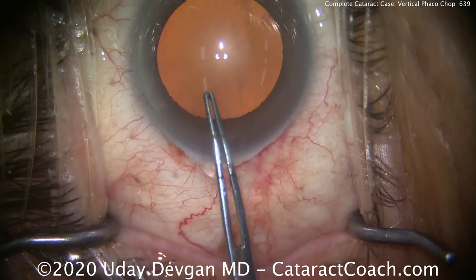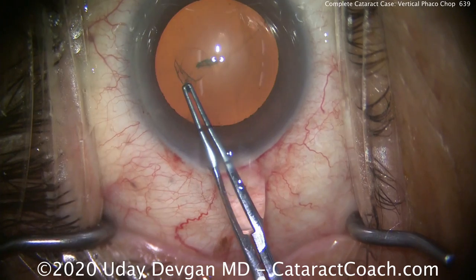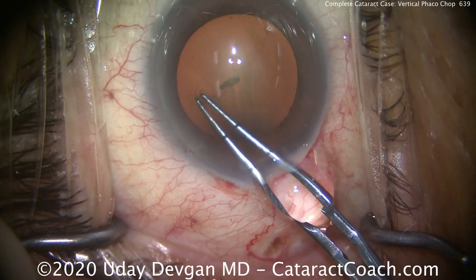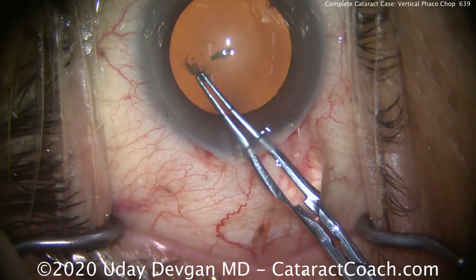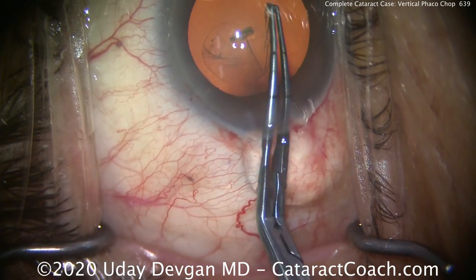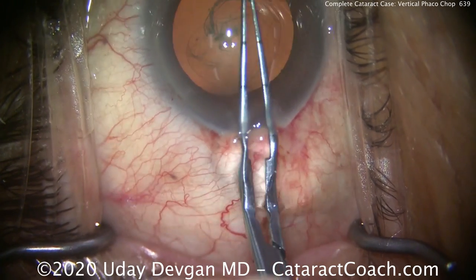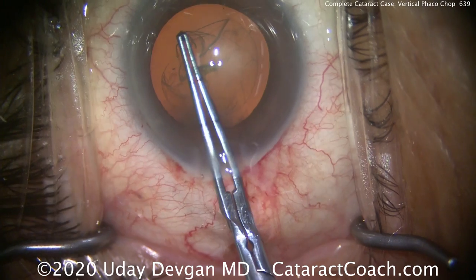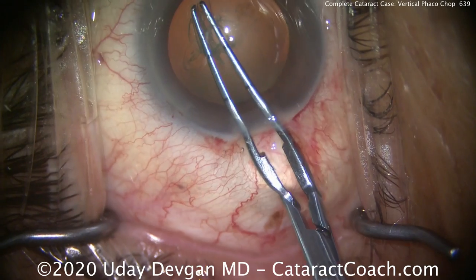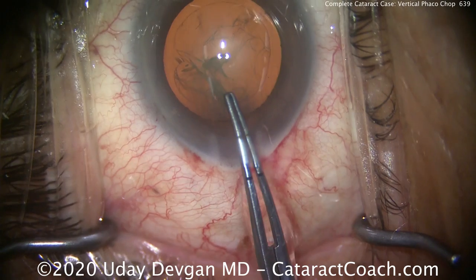Here come our forceps. We're going to create about a 5.5 millimeter capsular rhexis. Poke in there with the forceps and start tearing that rhexis. The trick here is to really do a lot of pivoting — watch this. The forceps are now tilted in that direction, with the base on the right and the tips to the left. Now look, we've flipped the pivot; the tips are going the other way and the base the other way as well. This whole pivoting technique is what allows us to have precision in the eye and also to create that nice roundness to the capsular rhexis, because we're just pivoting the instrument. That's how it ends up so round.